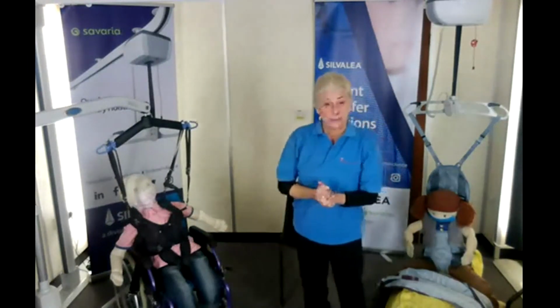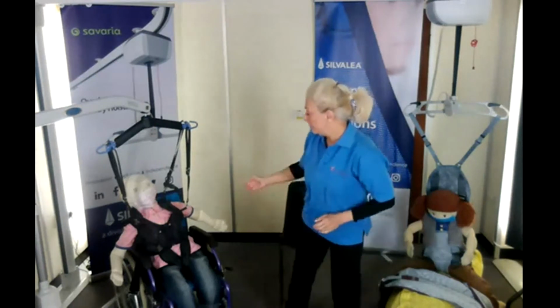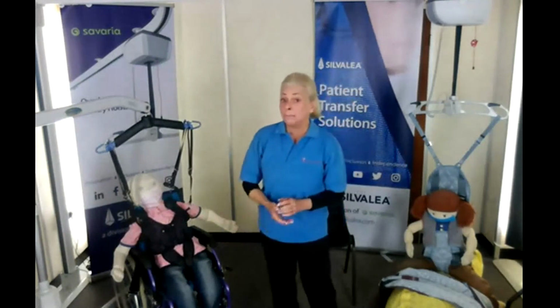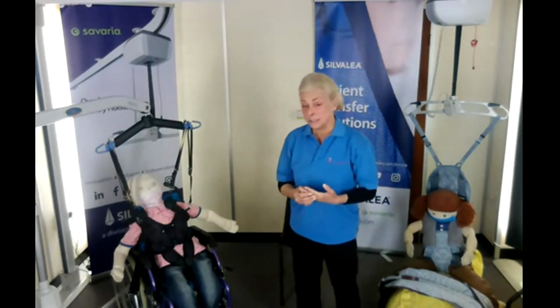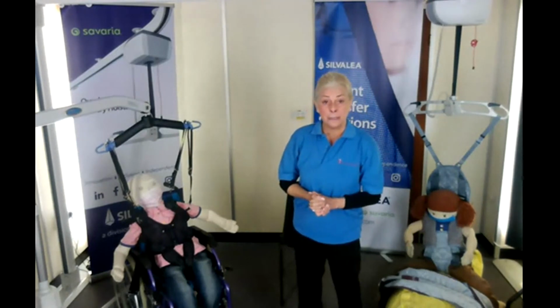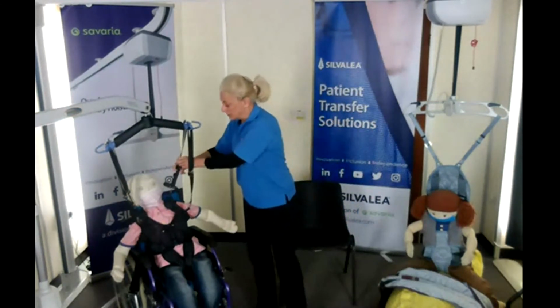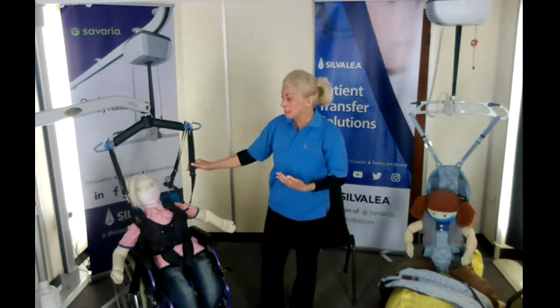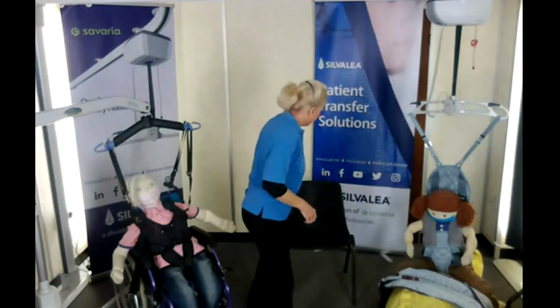It's a mesh. We know it's being transferred into swimming pools. So that type of situation, hydro, so that's fine. I'm just trying to think if there's been used in any other situation, but it can be made in adult sizes as well. You need to, of course, make sure you've got enough height with the hoist. But you know, harnesses can go on mobiles if they go high enough, or overhead. So certainly those are the options there. The sliders are adjustable, so you can get more length and shorten it if necessary. So that's the Rachel harness. The other little harness we've got is the Jolly Jumper here.